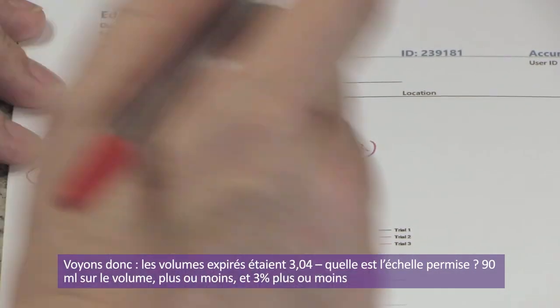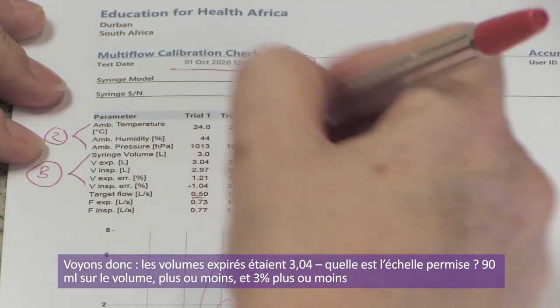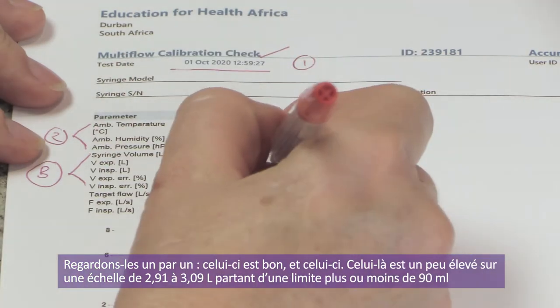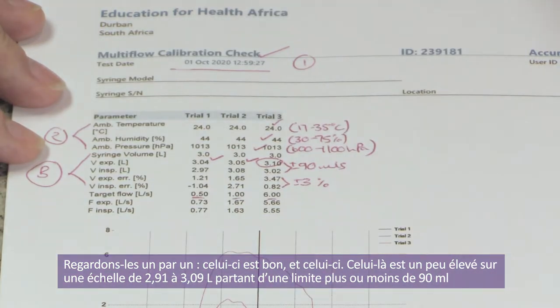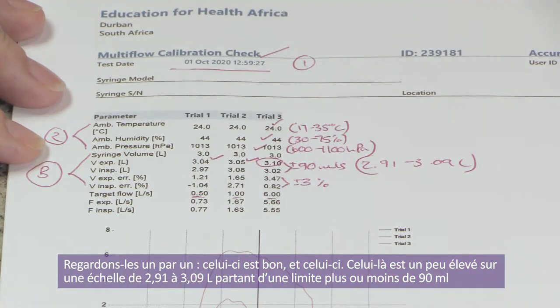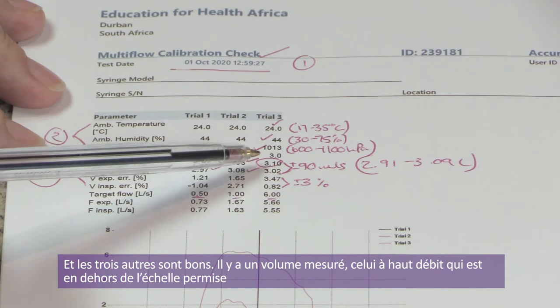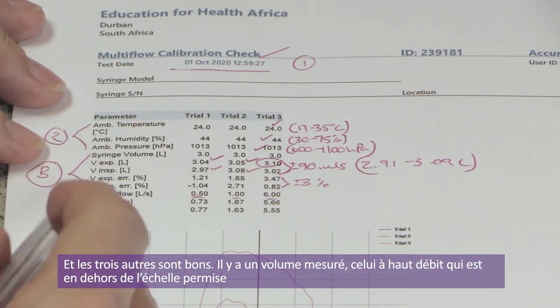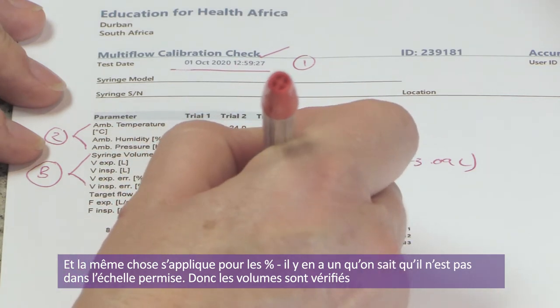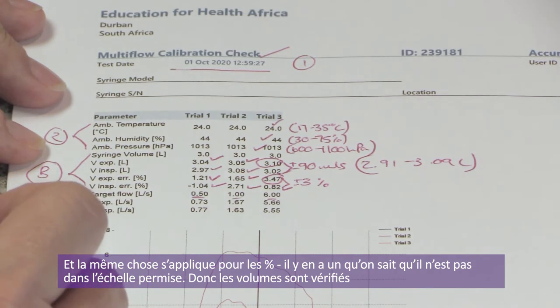The allowed range is plus or minus 90 mils, meaning 2.91 to 3.09 liters. Low and medium flows are within range, but the volume measured at high flow is outside the allowed range. Looking at the percentage deviation column confirms the same result — the high flow expired volume is outside plus or minus 3%.